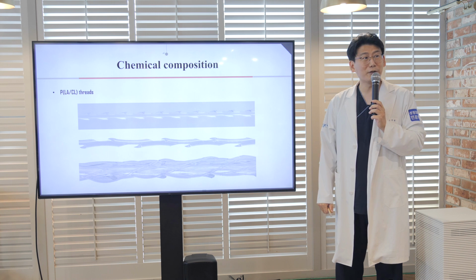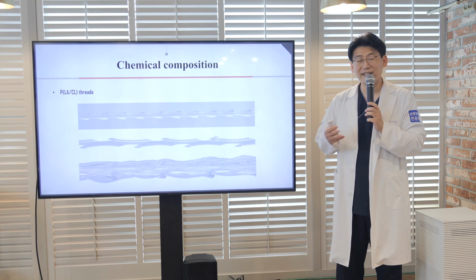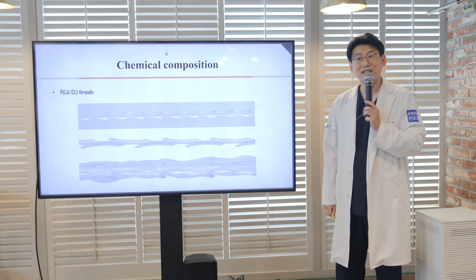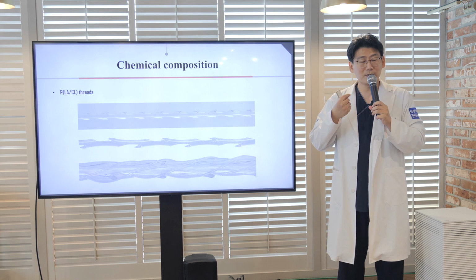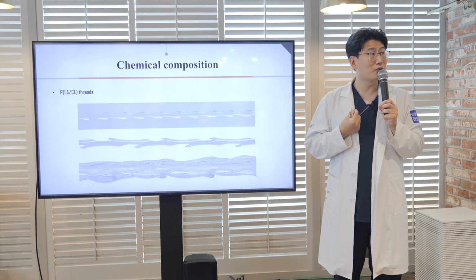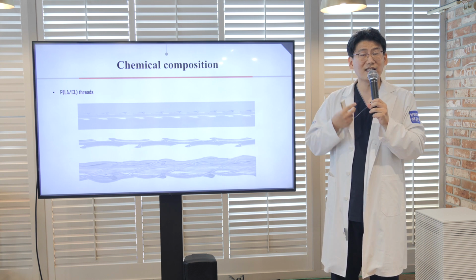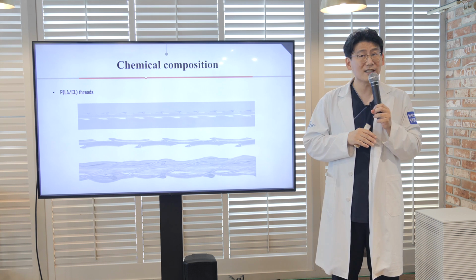It's very unique in the world. So you can use PLLACL or many kinds of PLLACL materials. But it's quite expensive. So in my case, I apply PDO thread mainly to get the duration effect. I can add some more PLLACL thread. It seems to be the best way for me.